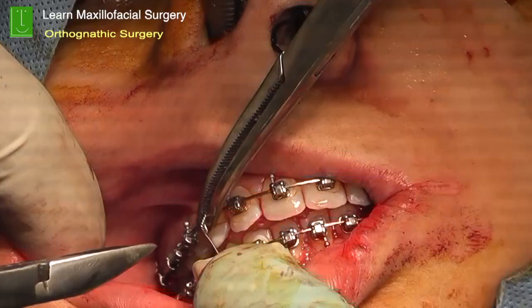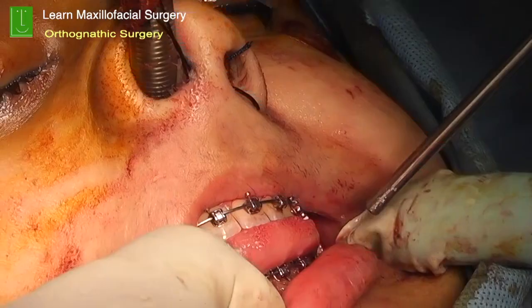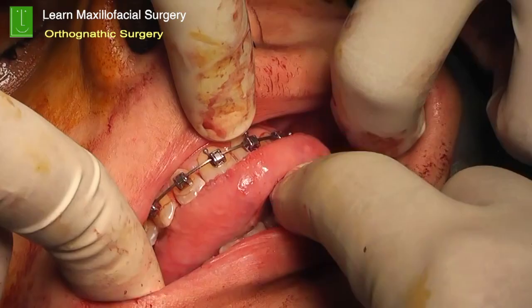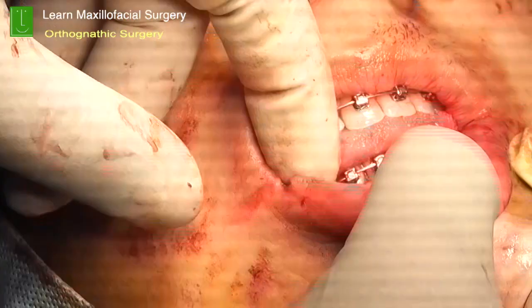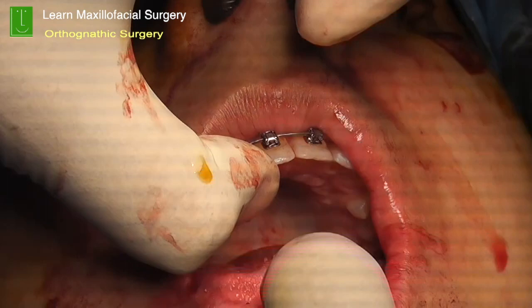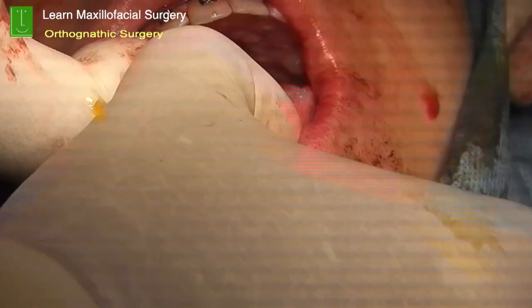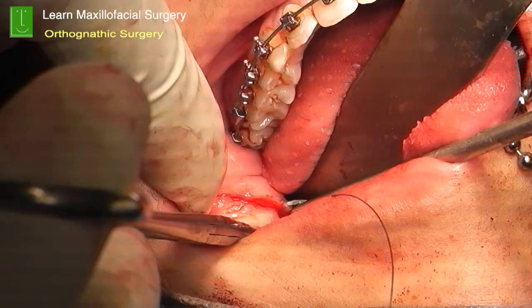Once the plates have been fixed, the intermaxillary fixation is removed and you check the occlusion. This is the moment we are waiting for, to see if the condyle is in the right position in the glenoid fossa. Sometimes you can dislocate the condyle anteriorly, and that is the reason why, whenever you're positioning and fixing the mandible after a sagittal split osteotomy, you need to ensure that the condyle is as far back as possible in the glenoid fossa. Never bring it forward, otherwise you end up with major issues. So getting the condyle in the right position, checking the occlusion, checking the lateral excursion, making sure that the condyle is in the glenoid fossa is the key. It's pretty simple and straightforward to make sure that the condyle is in the right position.